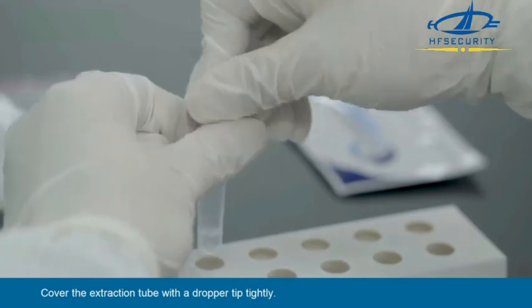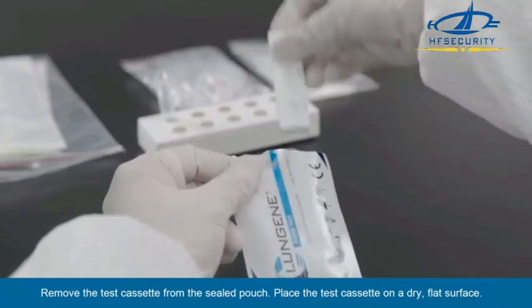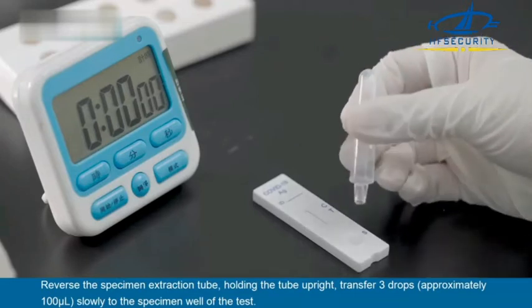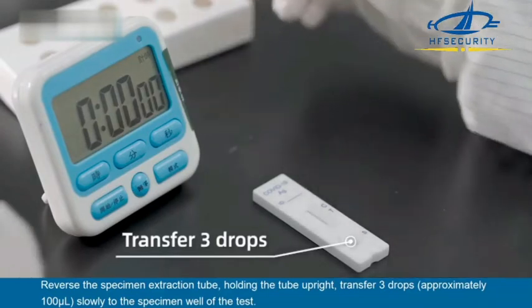Cover the extraction tube with a dropper tip tightly. Remove the test cassette from the sealed pouch and place the test cassette on a dry, flat surface. Reverse the specimen extraction tube, holding the tube upright. Transfer three drops, approximately 100 microliters, slowly to the specimen well of the test.